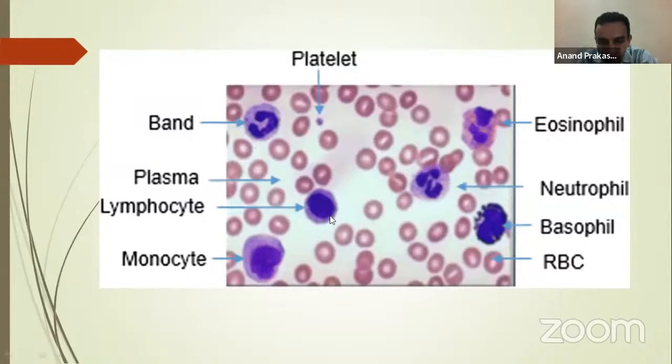In this nucleus, you're not seeing any nucleoli, small circles within the nucleus. If you see those, then you'll start thinking, is this a blast? That's why atypical cells versus blasts is sometimes a little tricky. If we are thinking of leukemia and the pathologist says, query atypical cells, then you really have to decide whether to do a bone marrow test. Whereas if this child has fever, lymphadenopathy, hepatosplenomegaly, rash and a coated tongue, I'm definitely thinking of, let's say, infectious mononucleosis. I get a lot of lymphocytes, some looking a little immature.